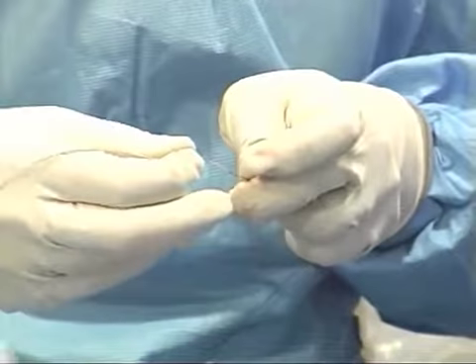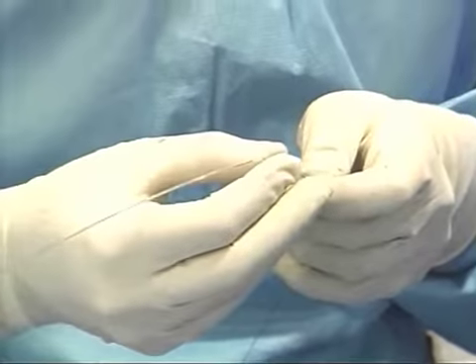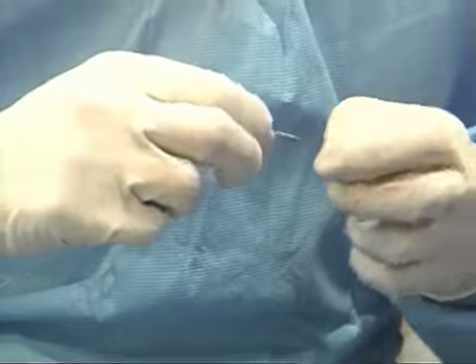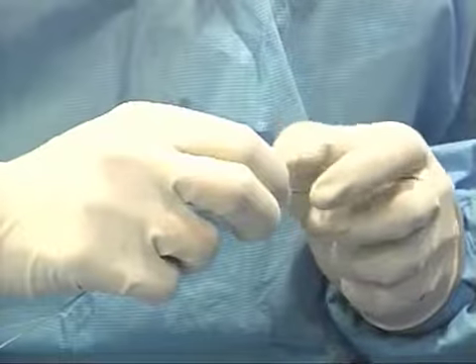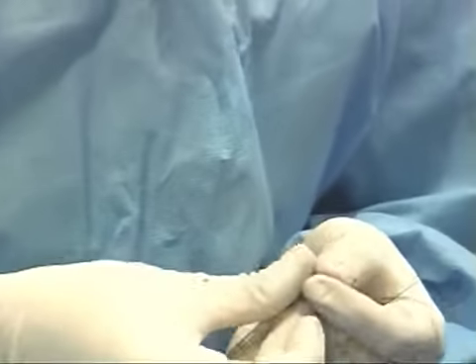Pedro, based on the angiographic appearance and what appears to be a satisfactory stent apposition, what would you predict would be the OCT finding? Well, actually, we move into the OM circumflex now. Otherwise, what are the criteria of OCT stent expansion? This is a very crucial and timely question.